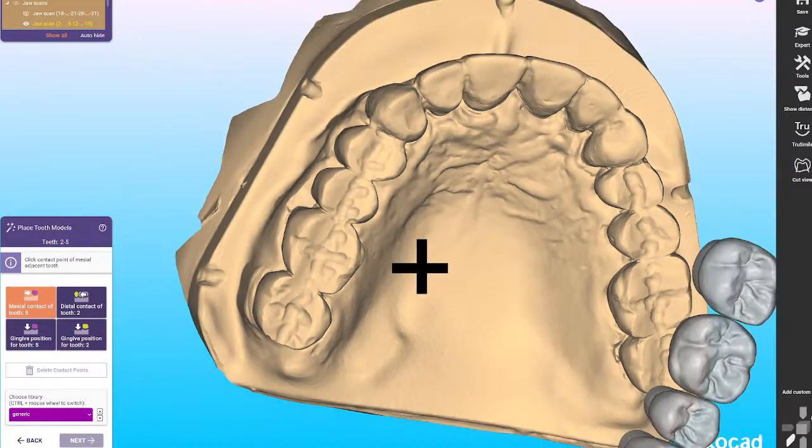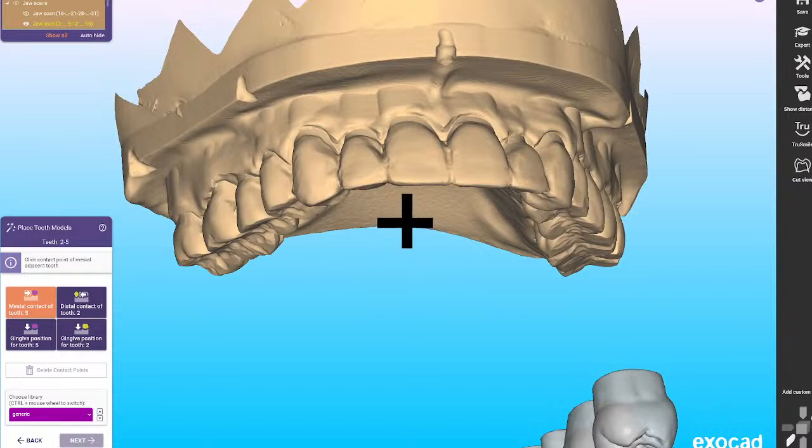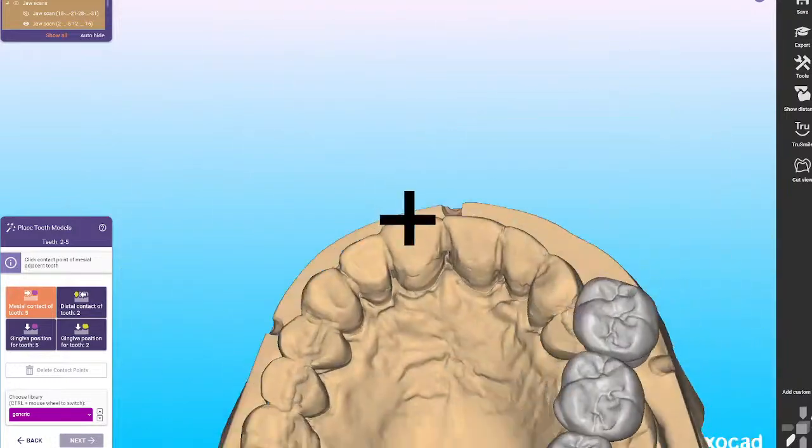Or the shortcut, which I recommend everybody learn, is N. You press N, it will show, and then you press N again, it will hide. And for the maxillary, you press X, and then you press it again, and it will hide. So learn the shortcuts, it's going to save you a lot of time.